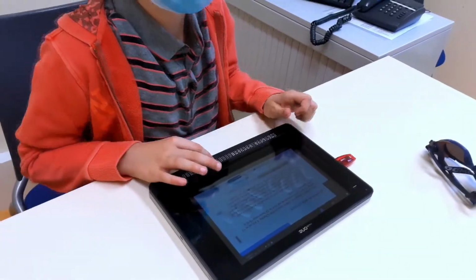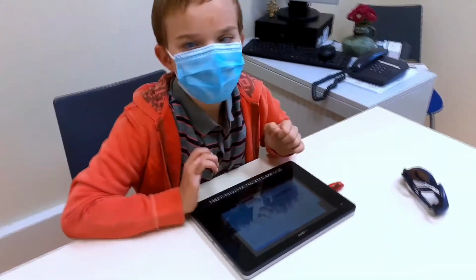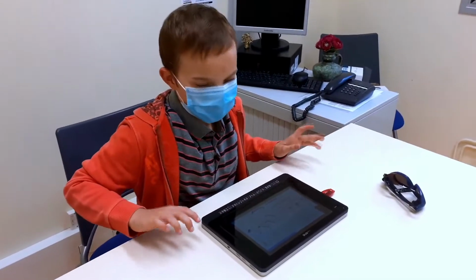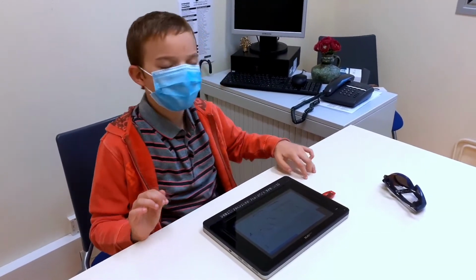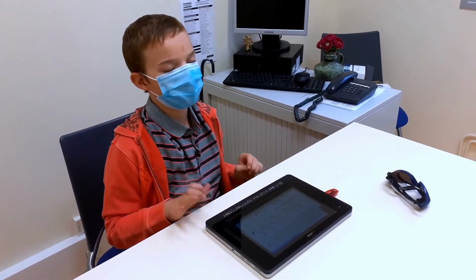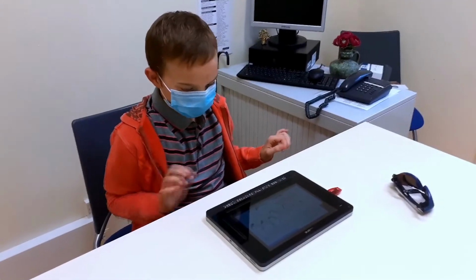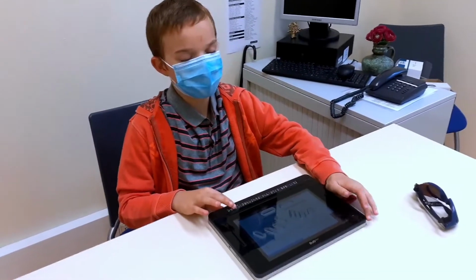If a teacher doesn't know Braille, can they write with your tablet? Yes, he can write, but with a different keyboard. It is a visual keyboard. If he wants to use the visual keyboard, when he hits a key, the letter is created. It is like the Braille keyboard, except that the letters are displayed. It is a computer keyboard. Yes, we call it a QWERTY keyboard. QWERTY, I have it here.